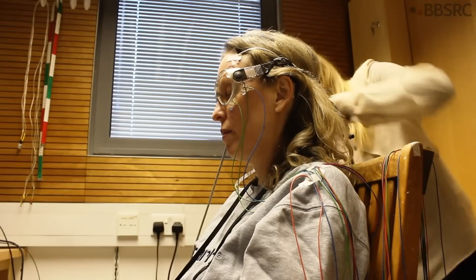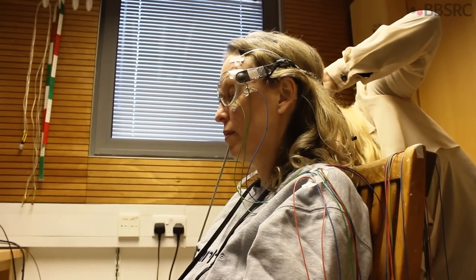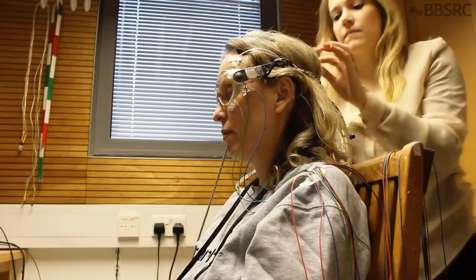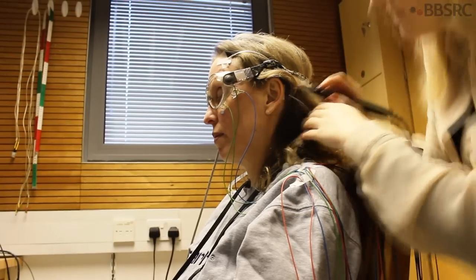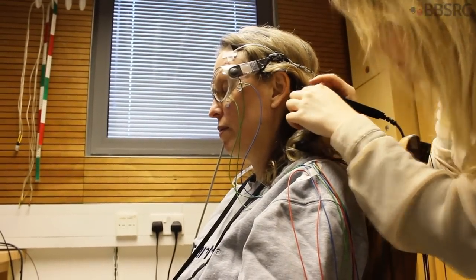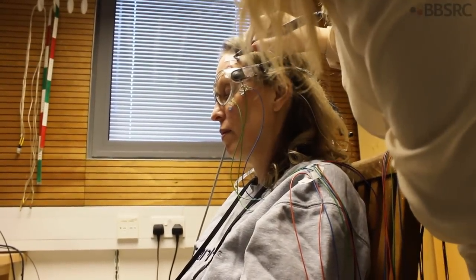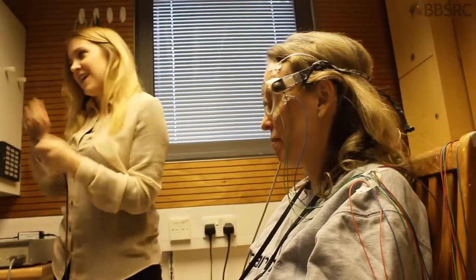The next thing I'm going to do is digitize your head shape using this electronic pen on various points of your head. You'll see your head shape appear on this screen, which tells the MEG system your head shape. When we get your MRI scan, we can overlay the two sets of images to see where all the activity is coming from and superimpose it on your MRI scan.